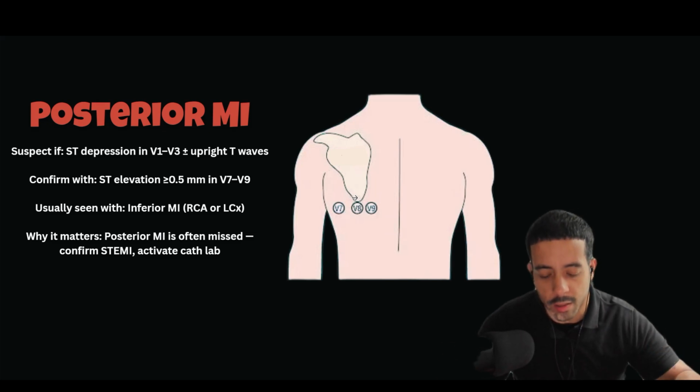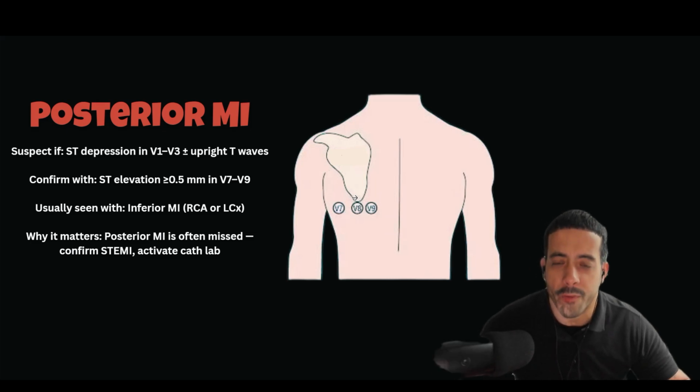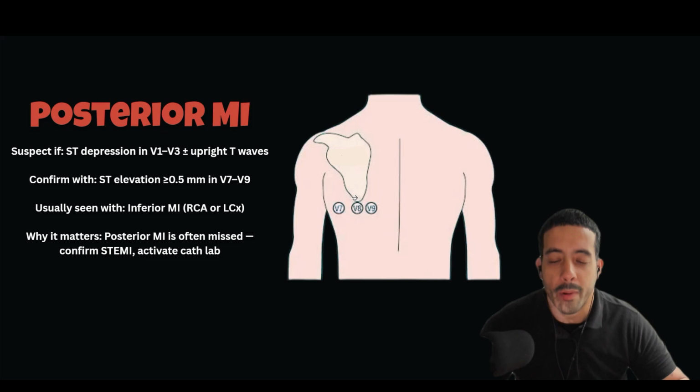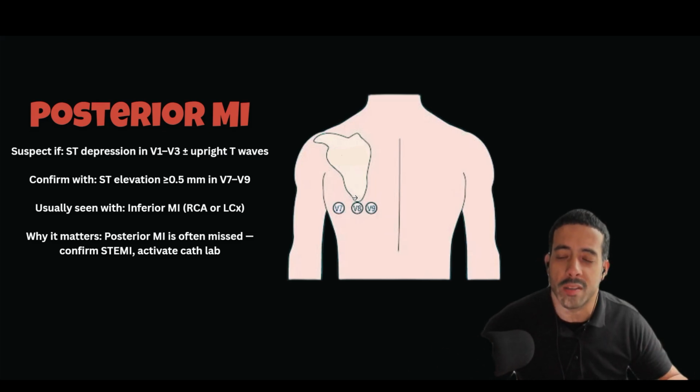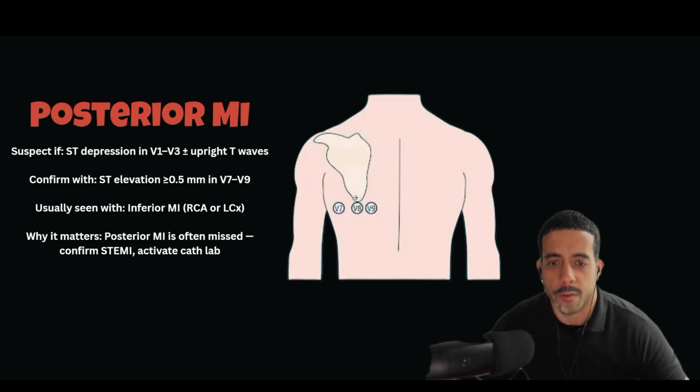So what I'm trying to say is the infarct, the ST elevation, is demonstrating and manifesting that something is happening to the anatomical structure of the heart. So by having an elevation or a depression, that confirms that something's going on in that part of the heart. And if you have reciprocal changes, which means one is elevated on one side and decreased on the other, if you have it decreased on V1, V2, and V3, then go ahead and do the back leads or the posterior leads to check to see if the person's having a posterior MI. I hope that makes sense.